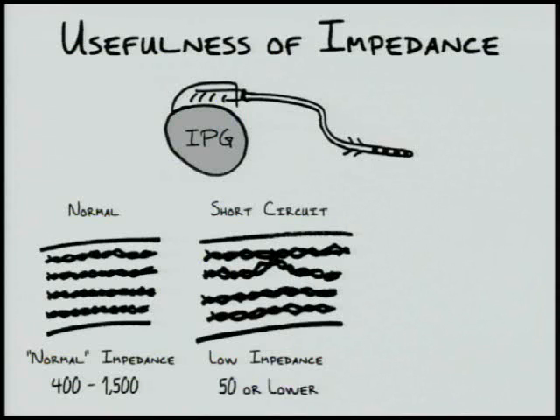Impedances measured with short circuits are generally very low, usually 50 ohms or less.